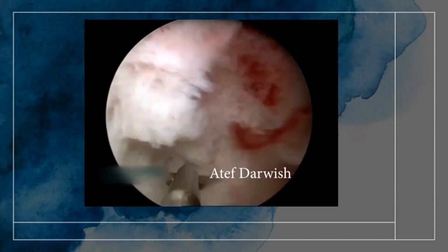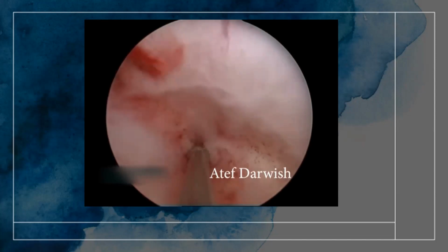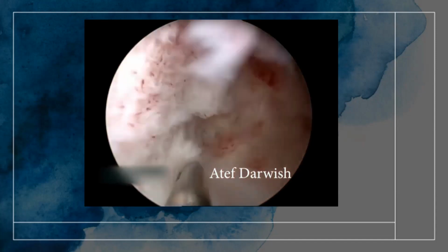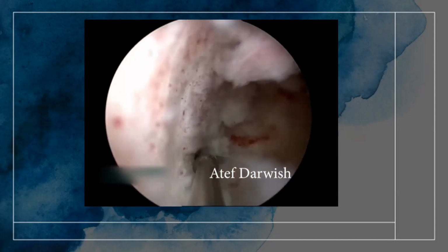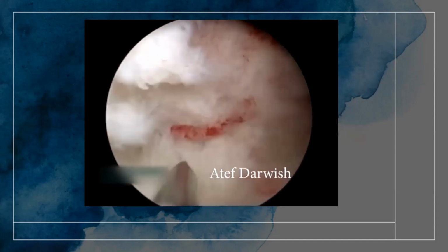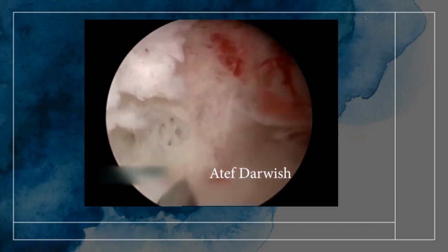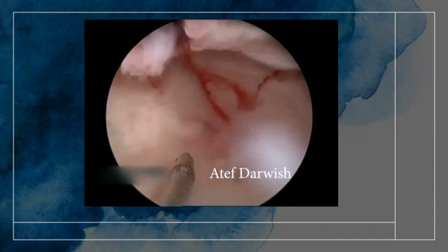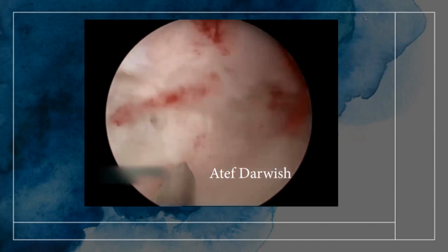You cut the thick adhesions, including the right side of the uterus, and every time you have to go to the left side to see the normal ostium and go in a horizontal plane to reach the expected site of the ostium on the right side, which is the base of the conical part, the Darwish Hysteroscopic Triad. Just continue to make adhesiolysis in a gentle and accurate way to avoid perforation of the uterus.